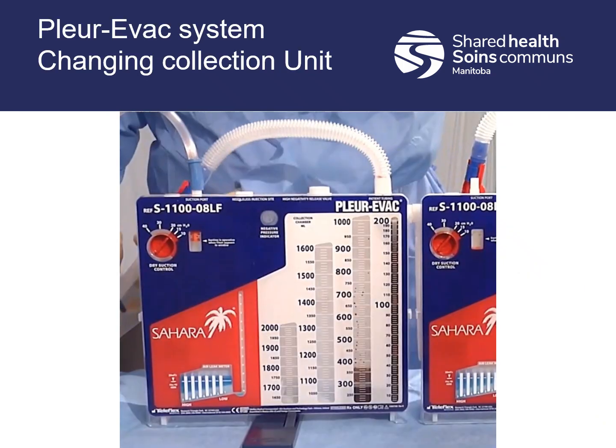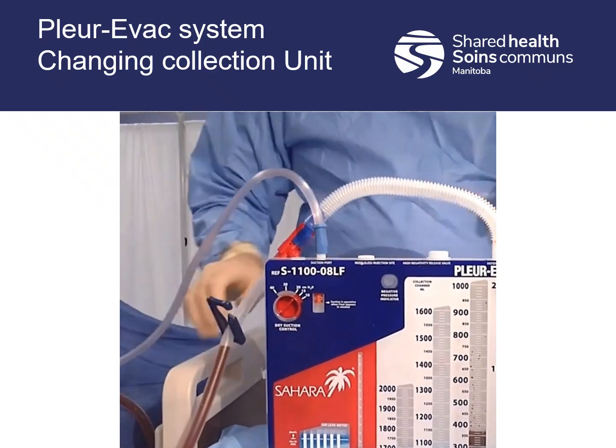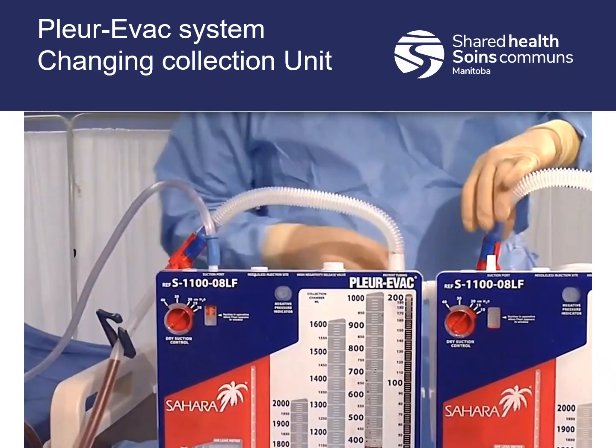Then we're going to clamp the tube on the original unit once we're all set up. This is really important. We're going to make sure that's clamped. We don't want to expose it to room air because, one, it'll bleed out everywhere, and two, it can cause pressure gradient differences in the patient, which isn't good. So make sure you clamp it first.